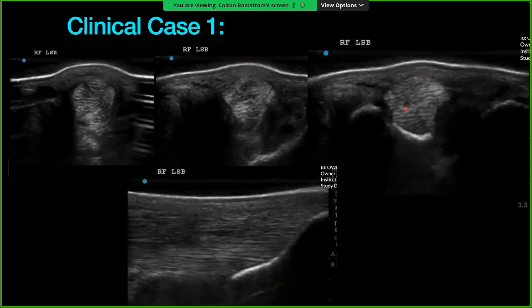And a little persistence of this core lesion, probably the same, just the distal extent of what we're seeing here. Long axis, the actual insertion at the sesamoid wasn't terribly abnormal, but we can see this clear disruption of fiber pattern in this more superficial 40, 50, 60% of the ligament that represents what we're seeing through here.